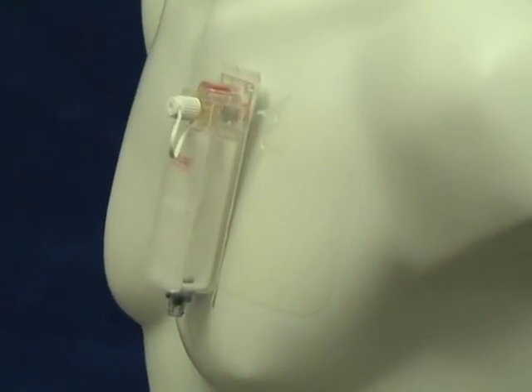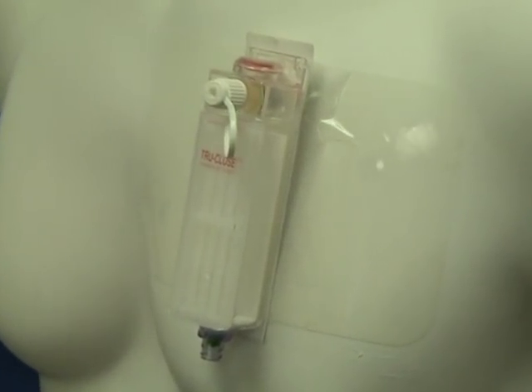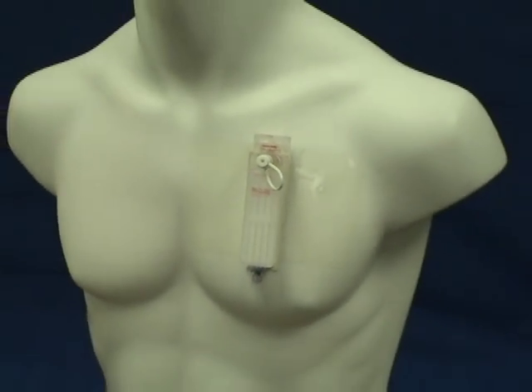The TruClose thoracic vent has been designed for the treatment of spontaneous, traumatic, or iatrogenic simple pneumothorax. It can also be used for evacuating air from the chest following thoracic surgery.